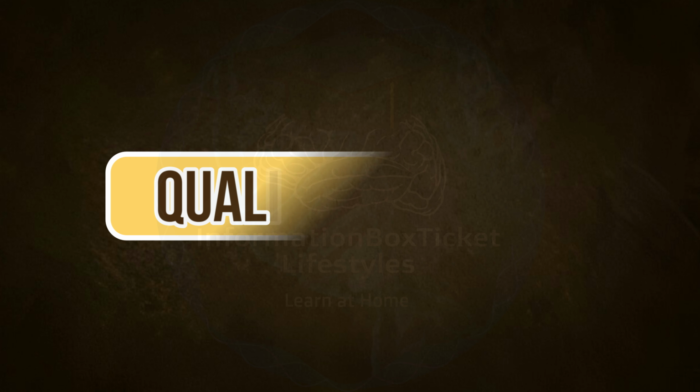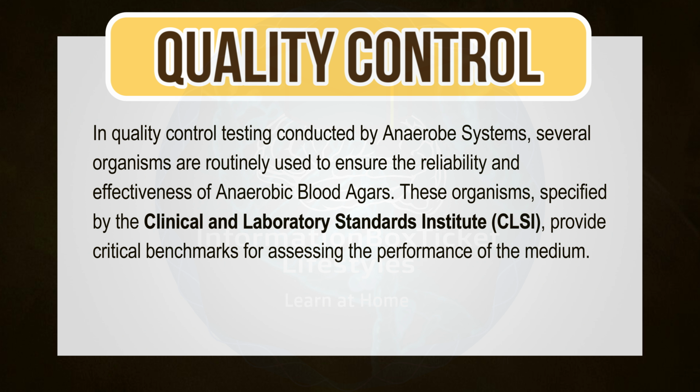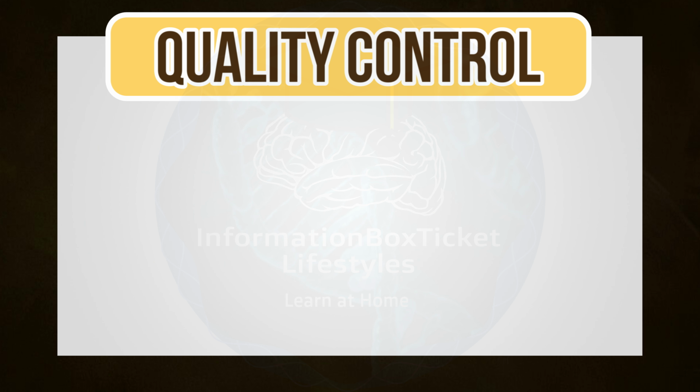Quality control of Brucella agar. In quality control testing conducted by Anaerobe Systems, several organisms are routinely used to ensure the reliability and effectiveness of anaerobic blood agars. These organisms, specified by the Clinical and Laboratory Standards Institute, CLSI, provide critical benchmarks for assessing the performance of the medium. Here are some key details.